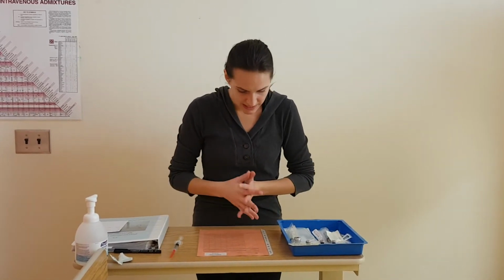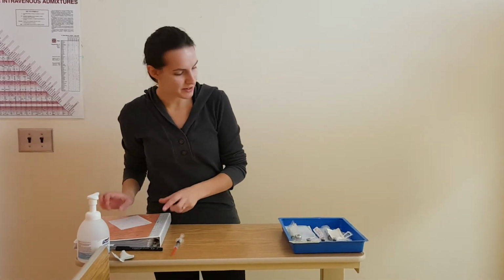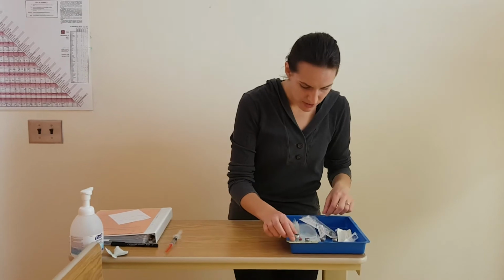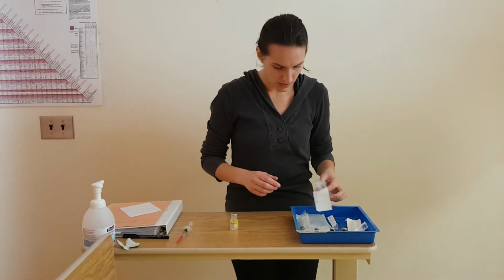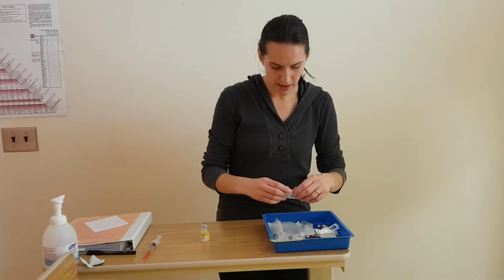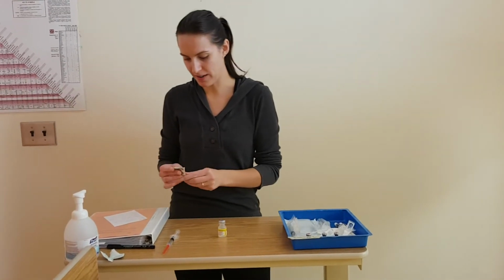So I've done my second medication check. At this point, I am going to dilute my medication in my CIVA syringe. So I've determined that I'm using normal saline as mentioned before, and I need just an additional 1 milliliter. So I'm going to swab my vial for 30 seconds and let dry for 15.